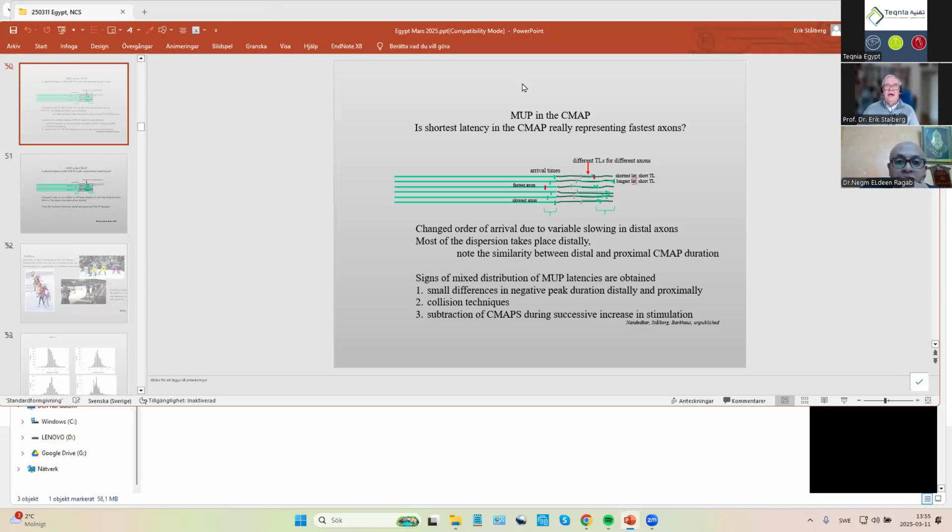If we have a longer distance, for example, 10 centimeters, we cannot say exactly where the problem is lying, if it is in the flexor ligament here, or if it is under the elbow, or where it is. Therefore, we do not use 10 centimeters; 5 centimeters is a little better. And if we use only 1 centimeter, then it's a little more problem to measure exactly the distance.